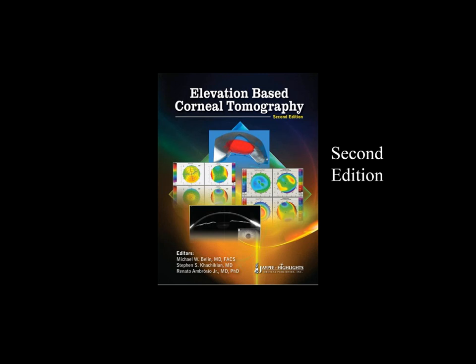I can't answer that definitively because no one yet has a real answer for that. I will say that for progression, and it doesn't apply to the U.S. because most of us still don't have cross-linking, changes on thickness and changes on posterior surface, if I see changes, even though the anterior surface is still normal, to me that's progression. And particularly in a young patient, that's when I really would want to intervene with cross-linking.